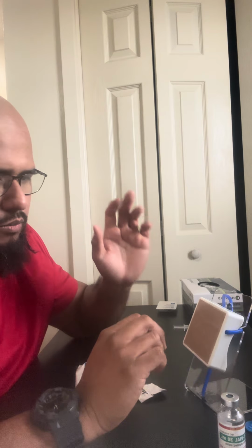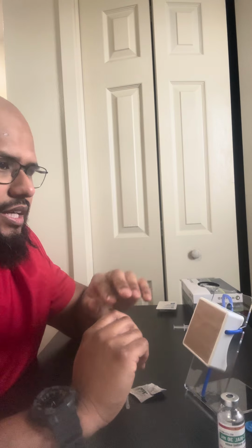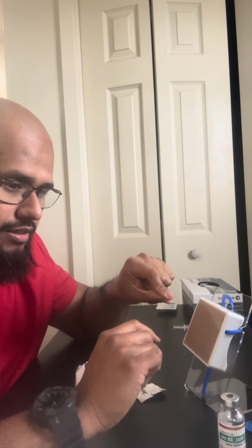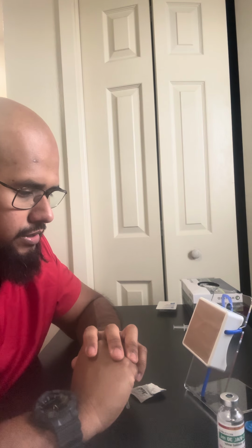And then same thing when you administer, just go very slow, 1 mL per 10 seconds, if I'm not mistaken. Once you're done, you hold down and don't take it out straight away. You'll hold for another 10 seconds to make sure it gets into that muscle. And yeah, that's pretty much it when it comes down to IM injections.